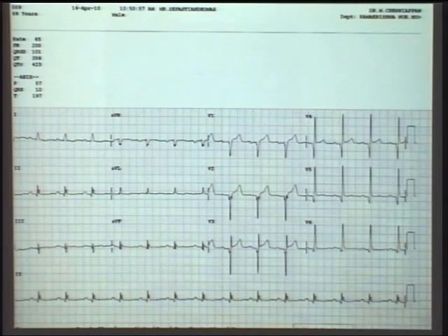So not only do you diagnose myocardial infarction, you also know what is below that particular electrode. For example, let us say V1 to V6, I have no R wave at all, only the Q wave. Let us imagine one ECG is showing V1 to V6, only the Q wave. What does it mean? Throughout our myocardium, I do not have healthy myocardium, so this patient has got a significant LV dysfunction. The whole of the left ventricular myocardium is dead, no healthy myocardium.